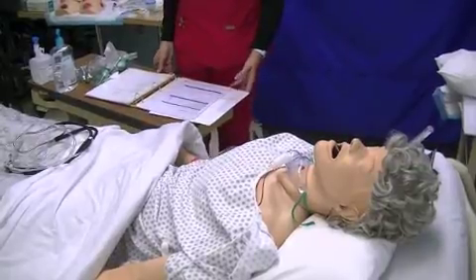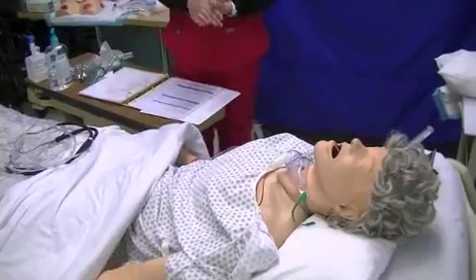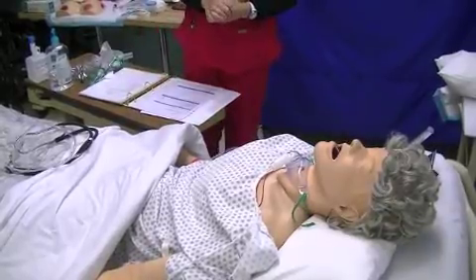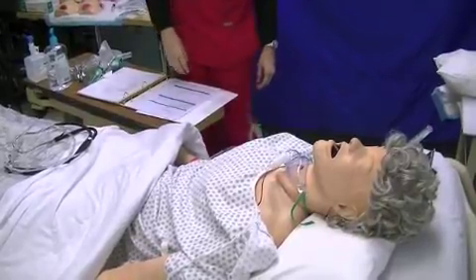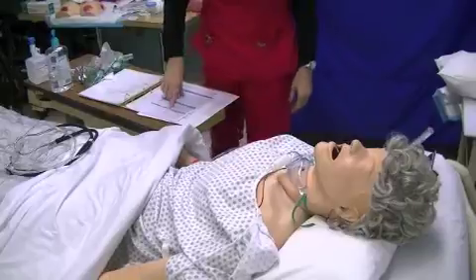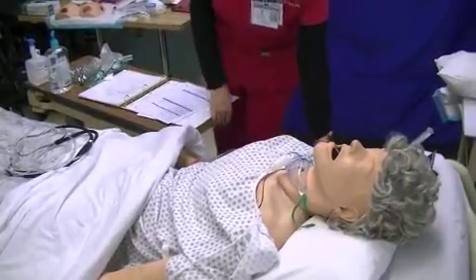Okay, Mr. Pierce, are you doing fine? Are you short of breath? Having your oxygen on, has it helped you? It looks like your O2 sat has increased to above 90, it's 95%, so you're fine. So we're going to make sure, are you having any pain? You look like you have relief of your shortness of breath. So we're going to make sure he's covered up, his body's in line.